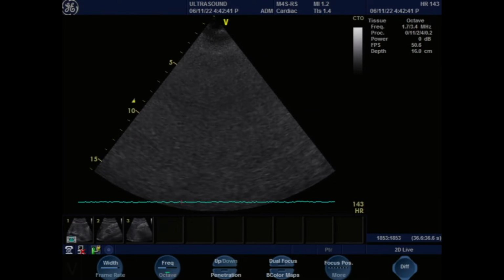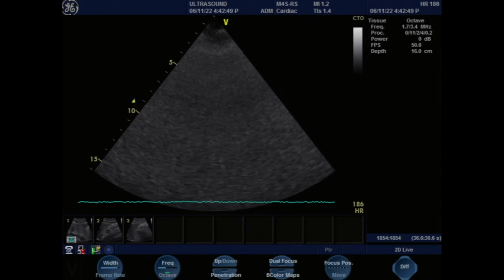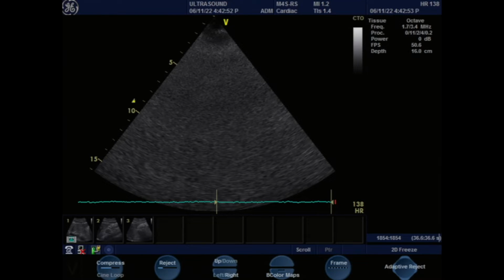Does the IVC volume correlate with the proBNP? Yes, for the most part it will. There are caveats with medicine. There's always caveats, right? Because the IVC size in most patients will correspond with volume status unless you have right ventricular failure, where the IVC is always going to be large because the RV doesn't work. So it will not necessarily correlate with the BNP.